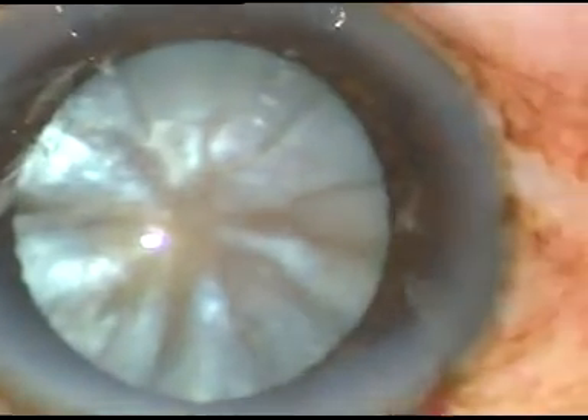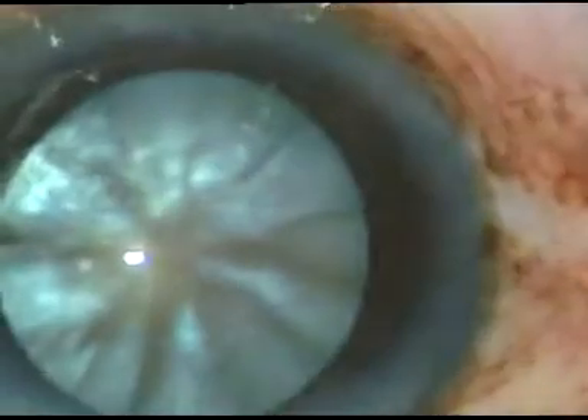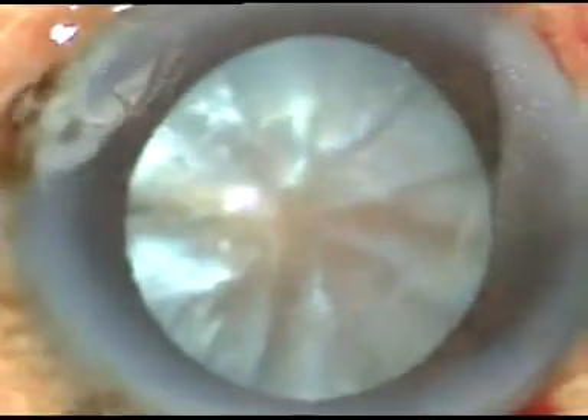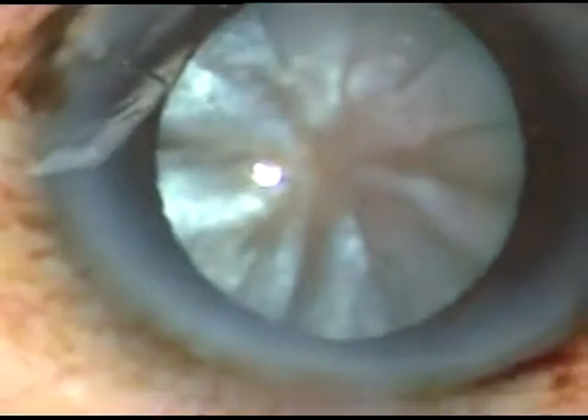This is a paracentesis incision on the right side of the main incision, about 2 and a half clock hours away. And this is another paracentesis incision on the left side of the main incision, about 2 clock hours away.